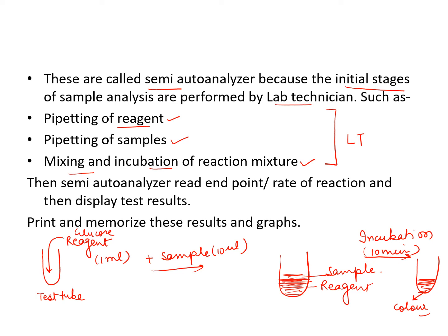Okay, then what will the machine do? Then the machine will suck the reaction mixture, and then the semi-auto analyzer reads this mixture. Maybe this reaction is endpoint or rate of reaction or kinetic reaction. Okay, a reaction may be of two types, endpoint or kinetic reaction, or nowadays fixed kinetic also.